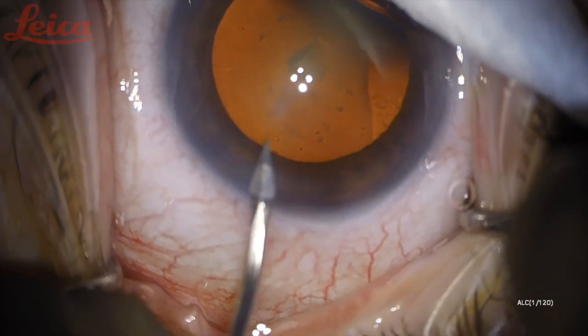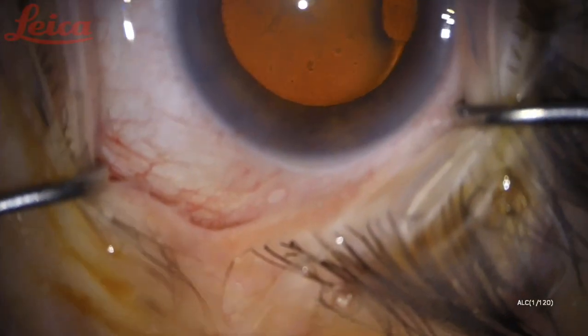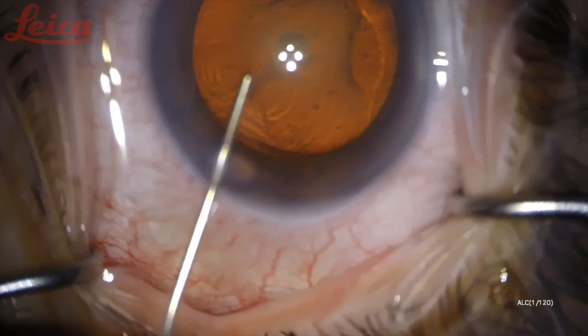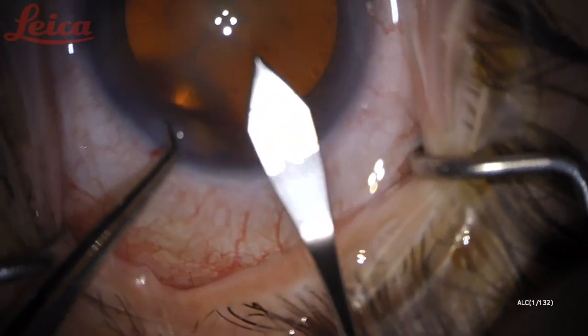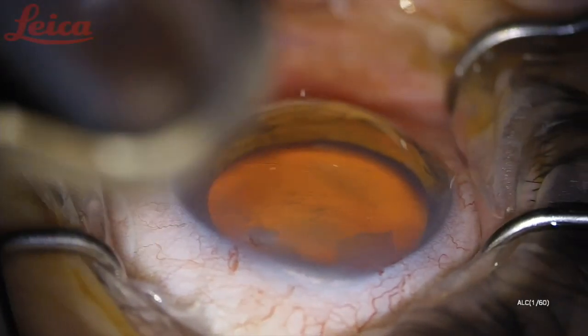As for any goniosurgery, you want to make your para just anterior to the limbal vessels. I like to use intracameral lidocaine for anesthesia, then viscoelastic, and then again a main wound that's just anterior to your limbal vessels. You want to avoid bleeding that will seep onto the cornea and obscure your view.